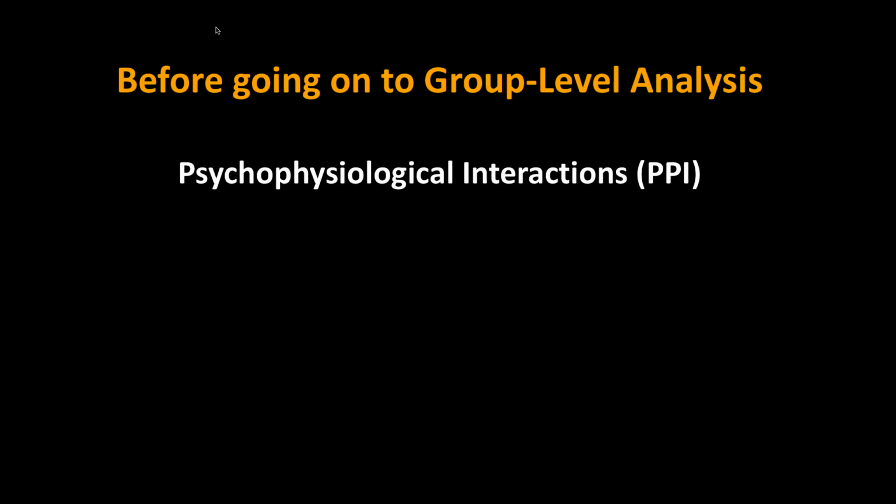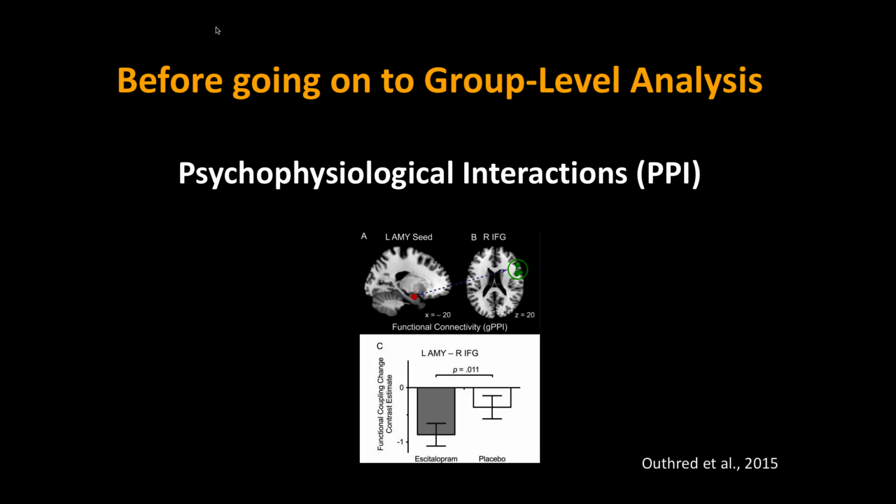Before I go on to talking about group level analysis, this seemed to be the right place to put this in. Just to back up and talk about these PPI analyses. I talked about them briefly yesterday, these psychophysiological interactions.